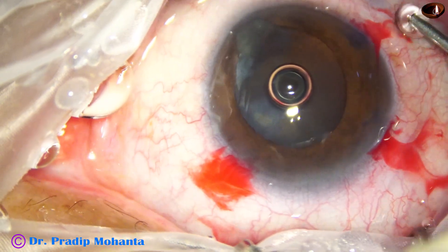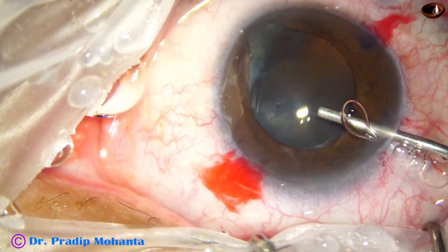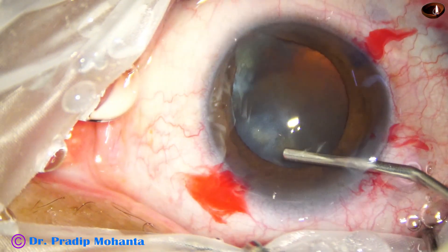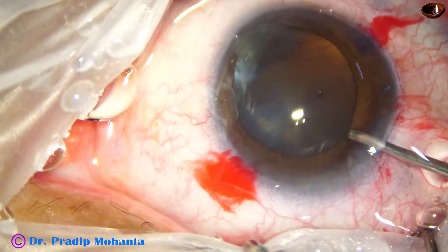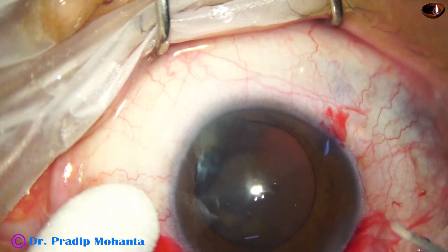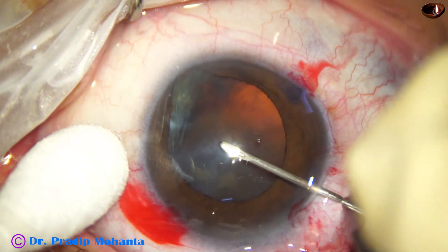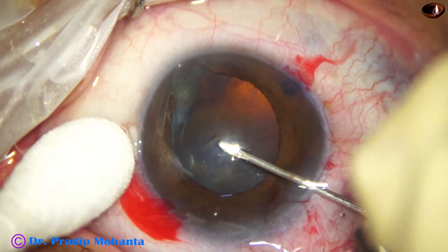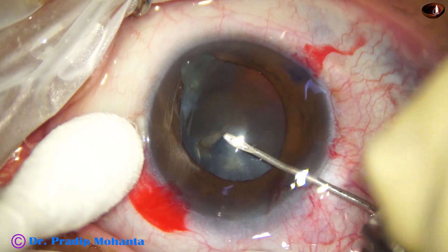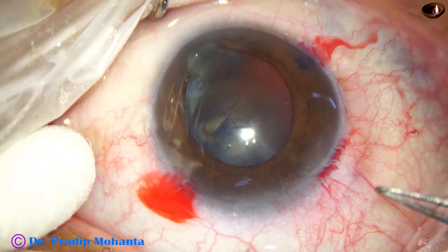The anterior chamber is now filled up with 2% hydroxypropyl methyl cellulose. Now capsulorrhexis is to be done. I am taking a needle to incise the anterior capsule and create a capsular tag. And now I use the utrata forceps.